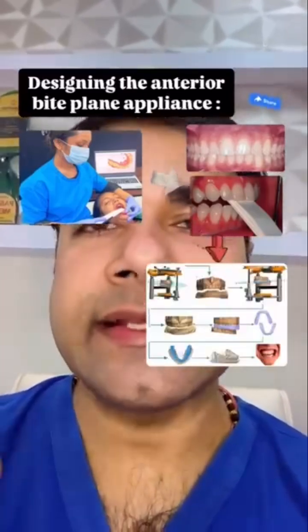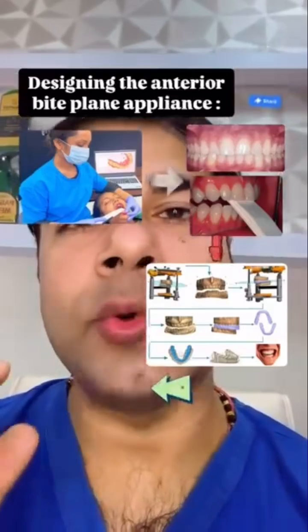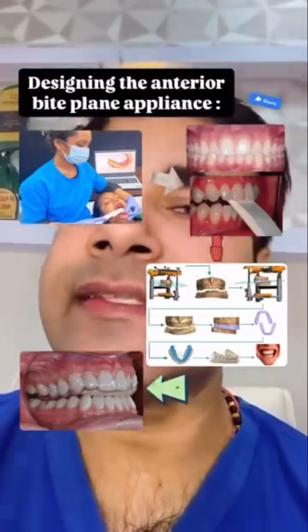When designing the appliance, raise the anterior platform to the opposing, then refine so that only the anterior teeth touch when closing and in lateral movements, and then send it for printing.